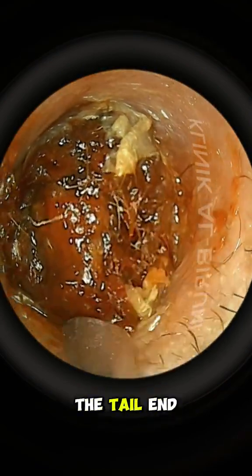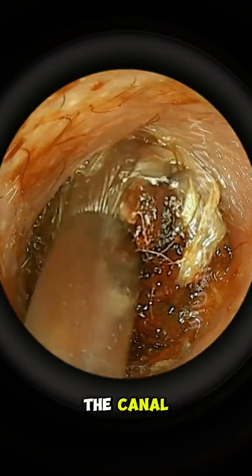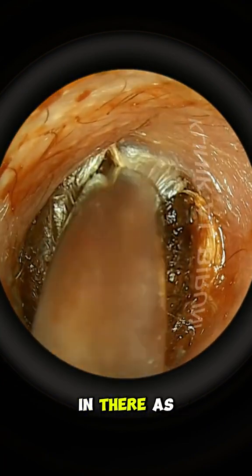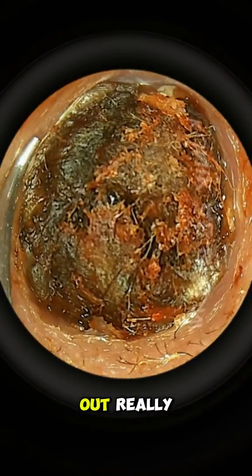You can see the tail end of this cotton bud here. We're just going to draw this down the canal. Look at that. It wasn't a small piece that came off, it was the whole end of the cotton bud as well. You can see there's a little bit of oil in there as well. So I think the patient had tried to shift it along with a bit of oil, but it came out really, really well.